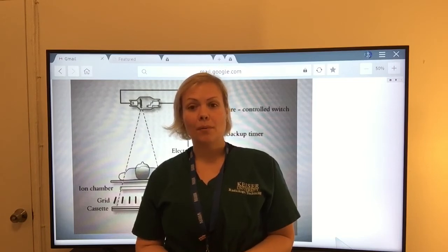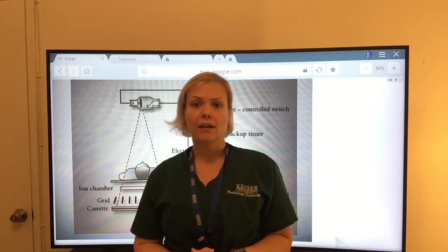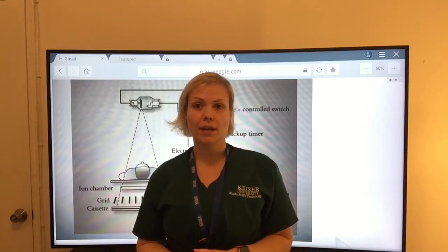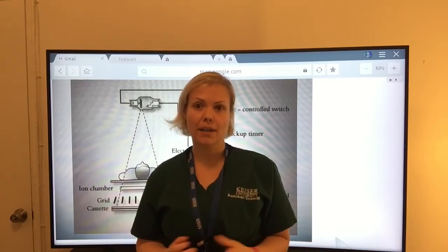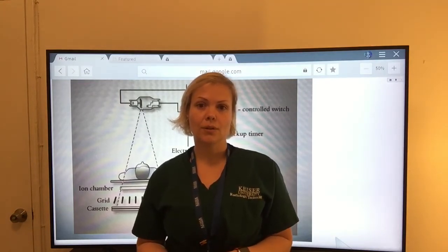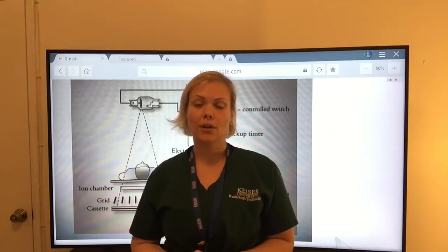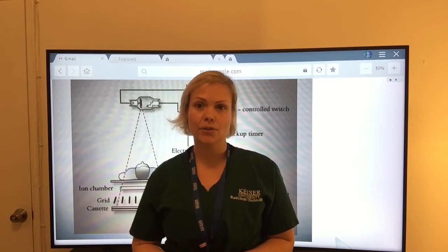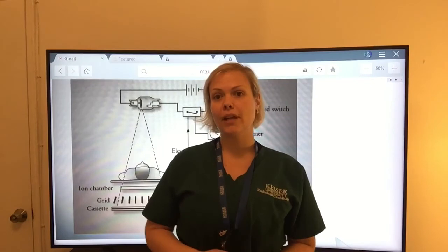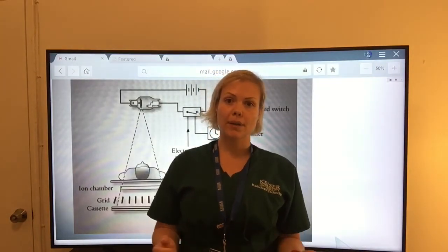It can be a problem with patients who cannot hold still, or pediatrics who are not following instructions. Also, the condition of the patient, such as Parkinson's, is complicated, so as a technologist you need to try to decrease the timing of your exposure. Often, the radiographer increases the mA to terminate the exposure time more quickly.